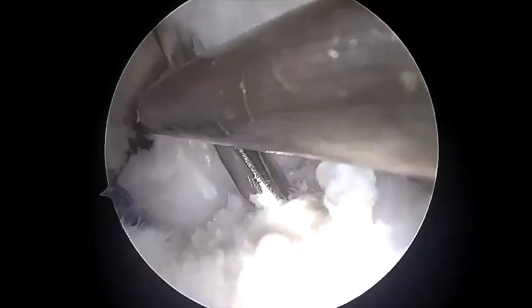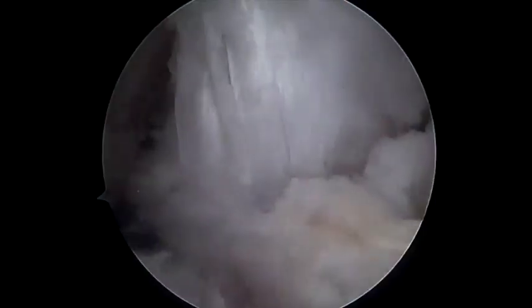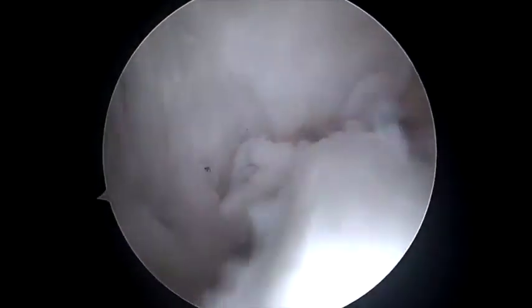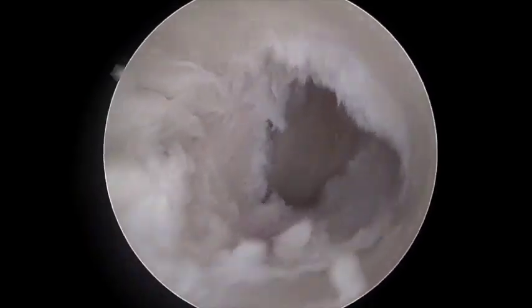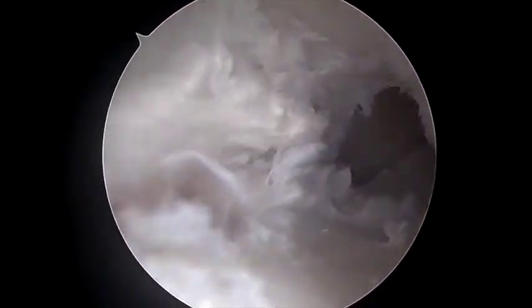The tibial tunnel for ACL revision is performed in the standard way using progressive reamers over a k-wire. The remnant of the graft is debrided inside the tibial tunnel. The tibial tunnel is inspected to confirm complete graft removal and the absence of convergence with the lateral root tunnel.